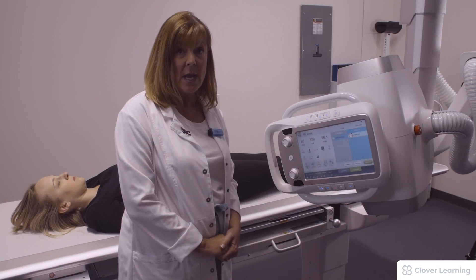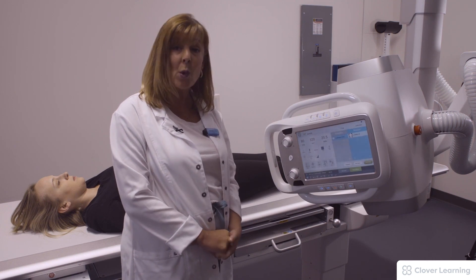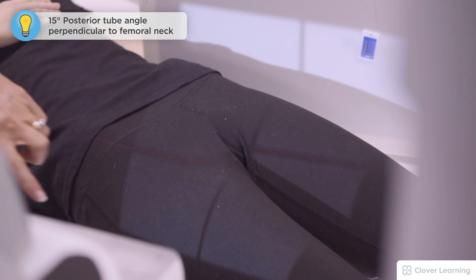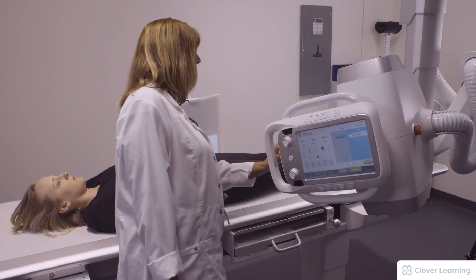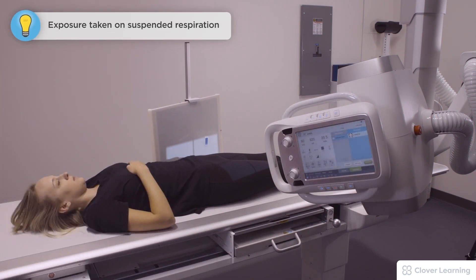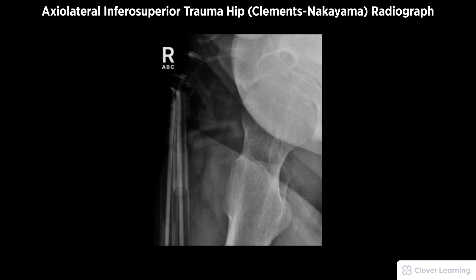This is an axial lateral view used when the patient doesn't have much movement or there is a bilateral injury and no good leg to move. For this left image, we are using a 15-degree posterior angle with the central ray perpendicular to the femoral neck. A left marker indicates the left side of the body, a 40-inch SID is utilized, the patient holds still, and the exposure is taken.